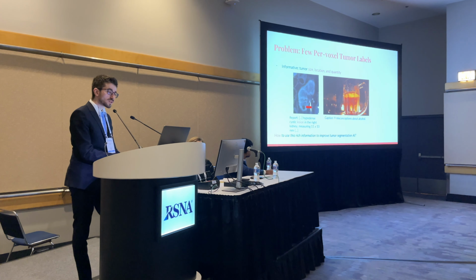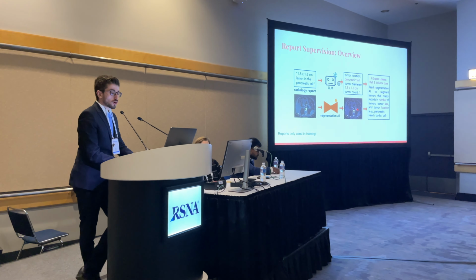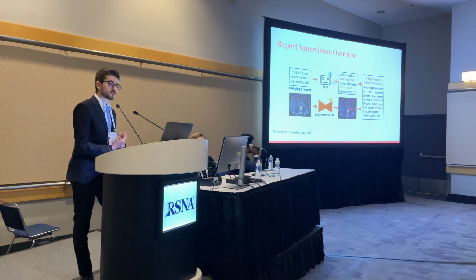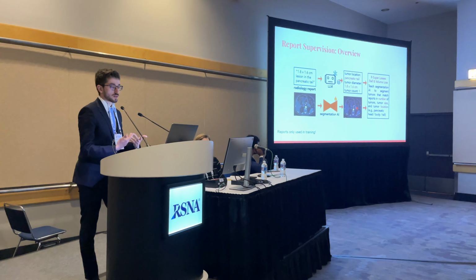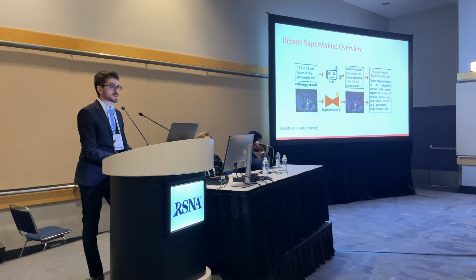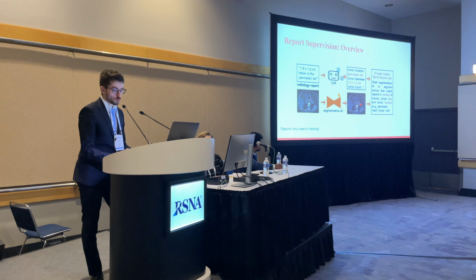So our question is, how can we efficiently use this information that we have at large scale to train tumor segmentation models? And our proposal is a new training methodology. We call it report supervision, or RSuper. Basically, RSuper can use reports to train tumor segmentation, either entirely substituting masks or in addition, as a complement to masks. So we begin by taking all the reports, and a large language model will read the reports and extract the important tumor information. So where the tumor is, which organ, which part of the organ the tumor is in, what's the diameter of the tumors, and how many tumors there are.